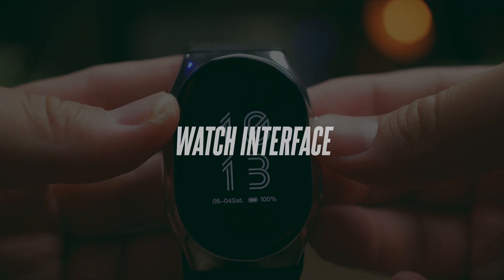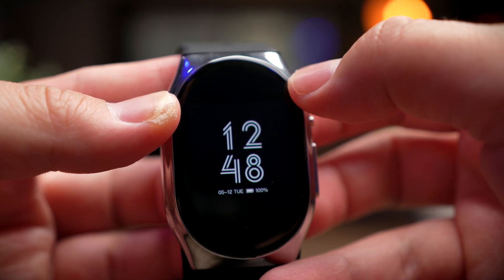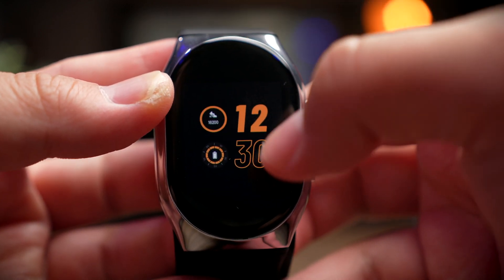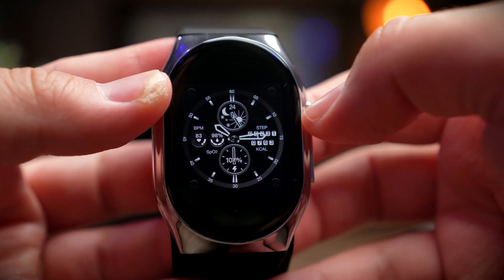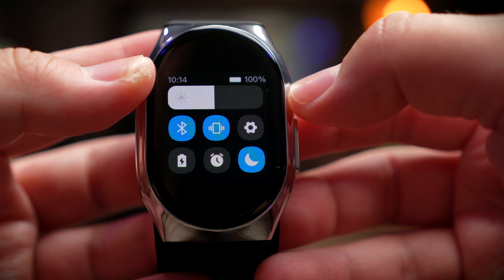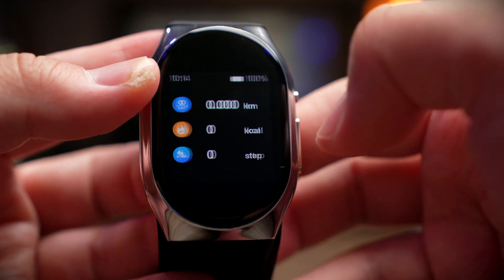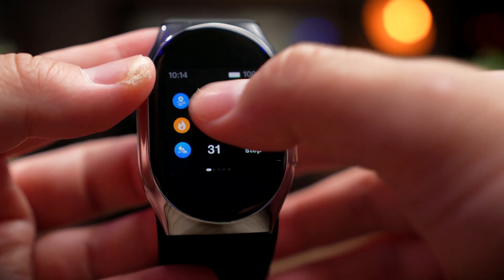The watch interface is really simple and straightforward. From the home screen you get your watch face, which you can change by long pressing, and you can add more from the app. Swiping down from the top gives you the command center for settings and controls. Swiping from the bottom brings up your notification center. Swiping from the left gives a simple daily summary — distance, calories burned, and steps taken.